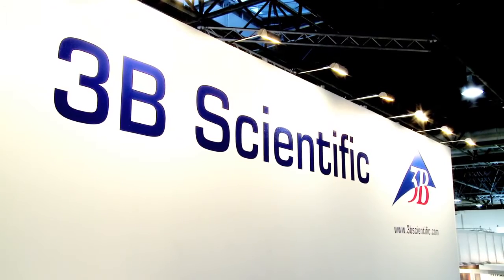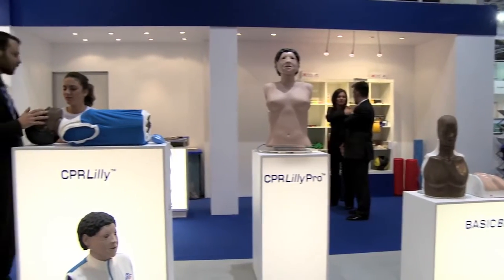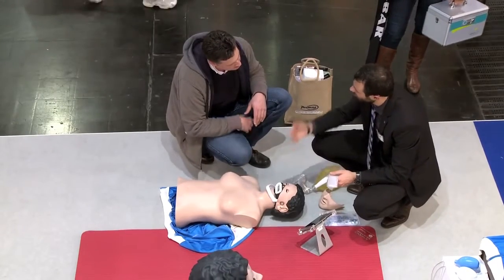3B Scientific is proud to present the new CPR Trainer Series, basic life support technology developed and made in Germany. These CPR simulators guarantee a realistic and efficient training for students and instructors.